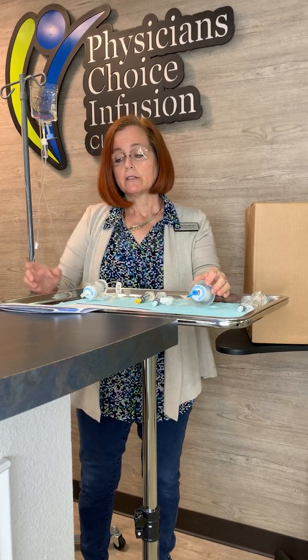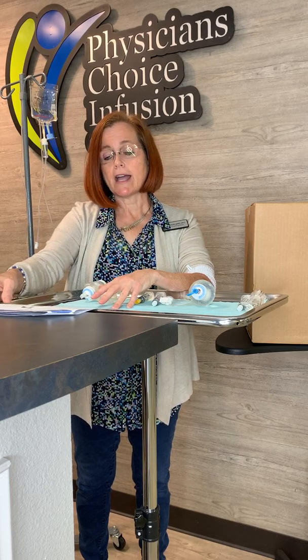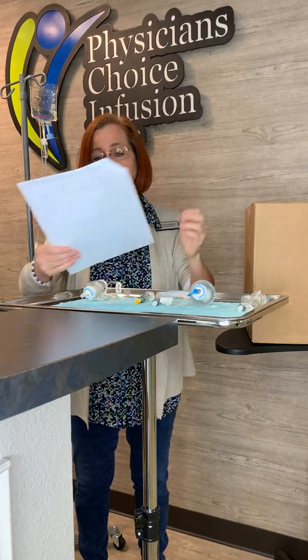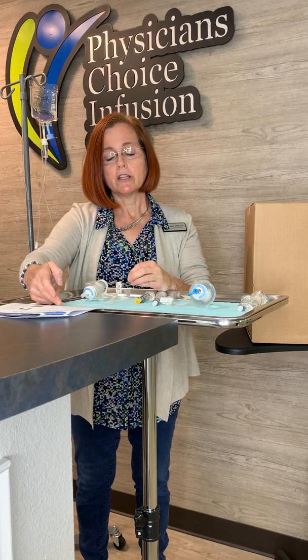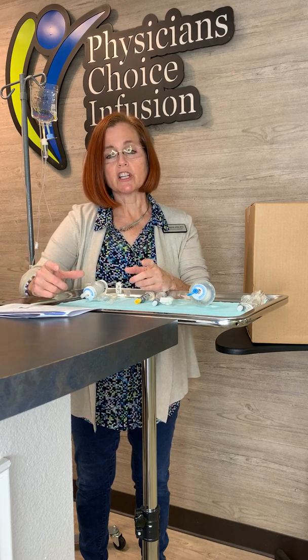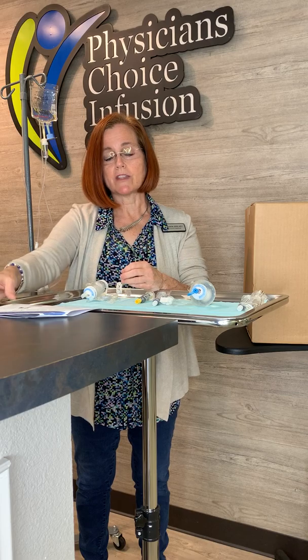Once your medicine is warmed up and you're ready to infuse, you're going to set everything up. Take out your pharmacy folder that's in the box. In that folder will be your orders, a list of the supplies that are in the box, and an instruction sheet on how to use the elastomeric device. Your first visit from your home health nurse, she will pull this out and fill it out. On there it has a place for your medication, your scheduled times for your medication, and the SASH protocol — which we'll be using when you infuse your medication.